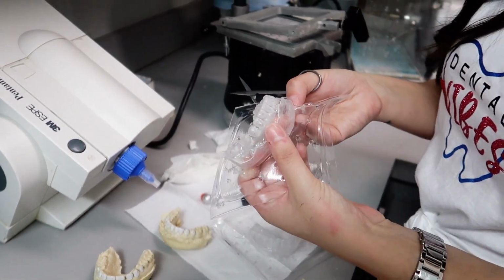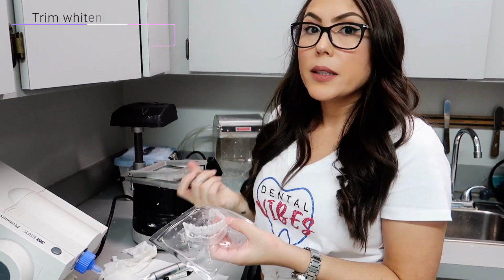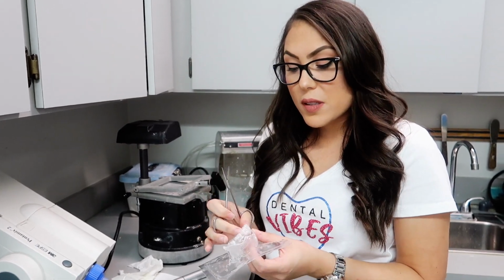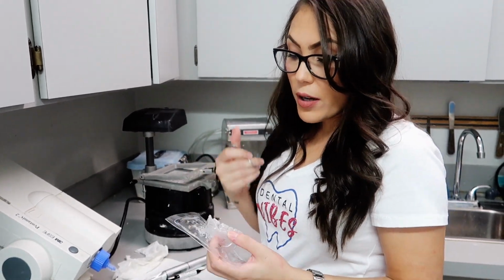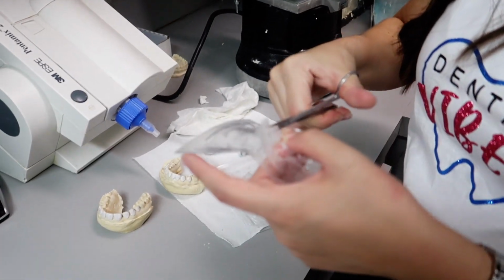I know that some people like to trim their trays scalloped, like an Invisalign retainer, which is fine. But when I do it, I feel like it doesn't come out as smooth. And if it's done properly, like it's super tight on your teeth, you don't really have to do the scalloped way. Remember, you did that barrier, right? That should prevent the gel from leaking through the tray. So what I do, I just try to trim it really closely to the teeth and make sure it's smooth all the way around, and that's that.